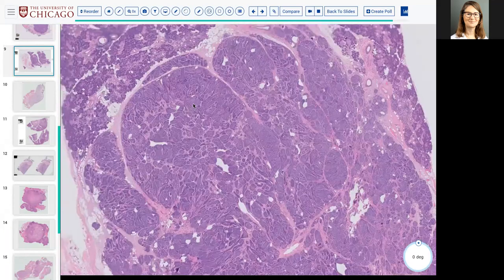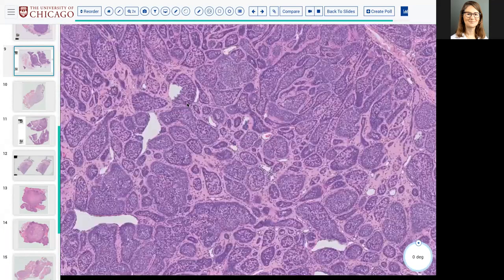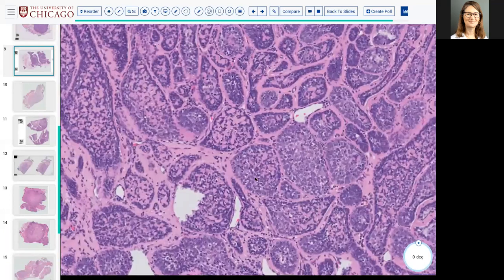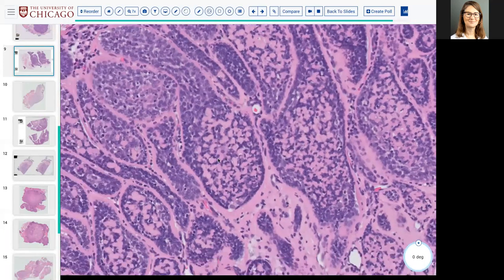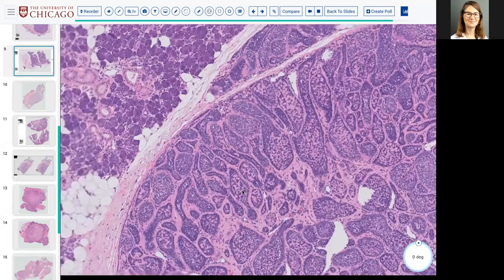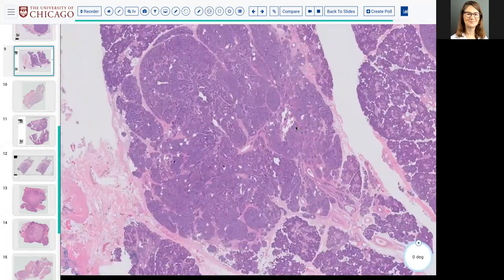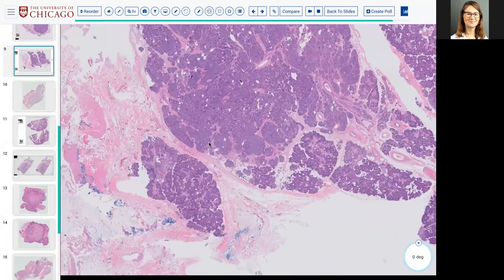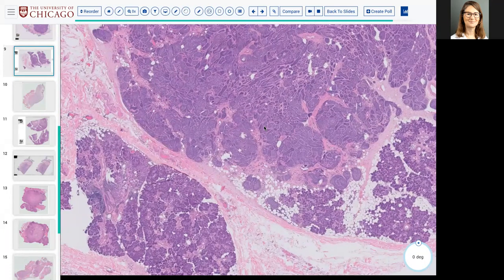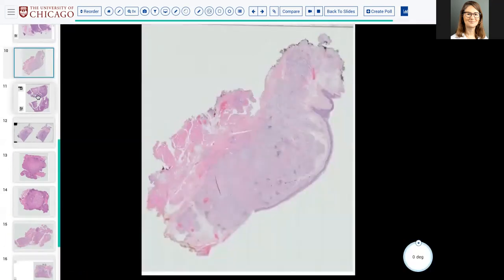You sometimes do not see beta-catenin mutations in these. So don't expect to see beta-catenin positive in these nuclei. In this case, it's very morphology driven with these nice globules, very nice trabeculae. Sometimes what are these tumors related to in the skin? Do you guys remember? Cylindroma. Yay, cylindroma. So these sometimes have the CYLD or the cylindroma gene mutation. The basal cell adenocarcinomas do not tend to have the beta-catenin mutations. And don't call these basal cell carcinomas like of skin. They are basal cell adenocarcinomas of salivary gland. So that would be the only caveat.